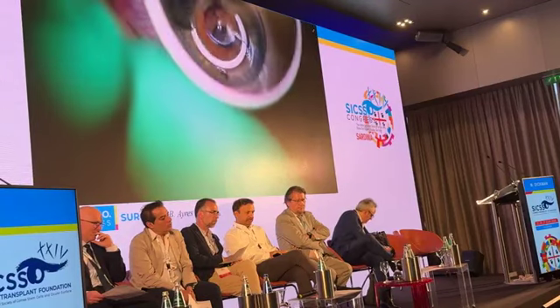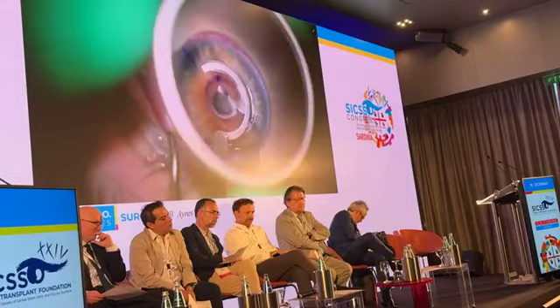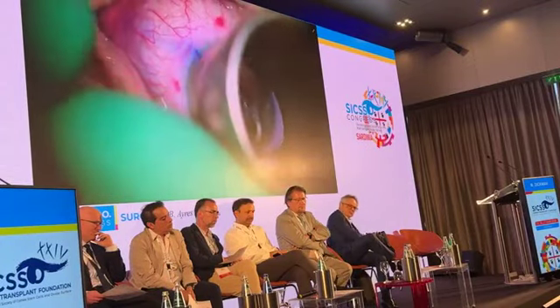And I'm trying extra hard to make sure I stay on screen for you guys. If I move off, just give me a little nudge. Sometimes it's hard to watch everything all at the same time. Get a good 360 degree dissection. It looks like it's open pretty nicely.